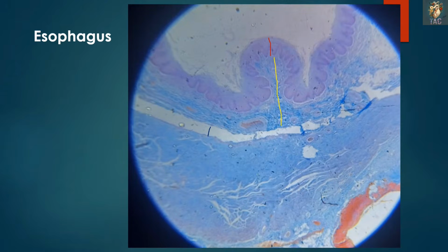And then you can appreciate over here the skeletal muscles which are present. So having all these points in mind, you should know first this is the epithelium. Looking at the slide, you can appreciate easily that this epithelium is stratified. Also it is non-keratinized. When we go to higher magnification, you will be able to see that this is non-keratinized epithelium. Below the epithelium you can see the lamina propria, and then the skeletal muscles forming two muscle coats, the inner circular and the outer longitudinal.